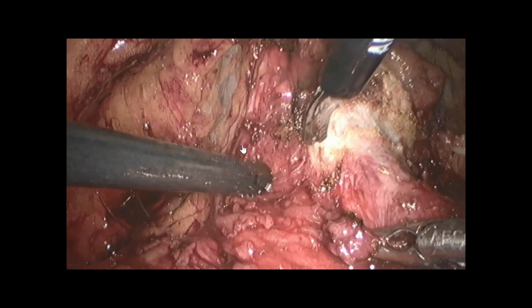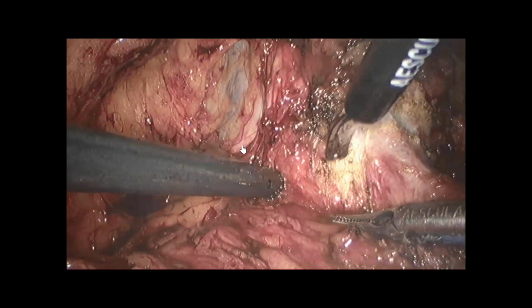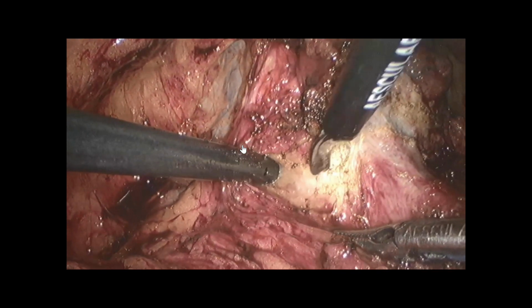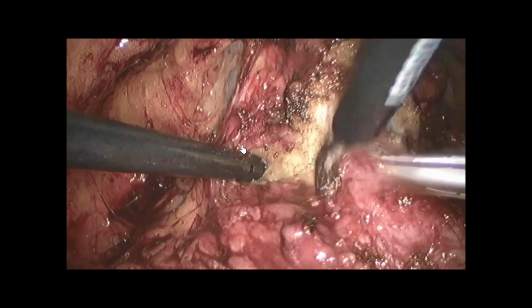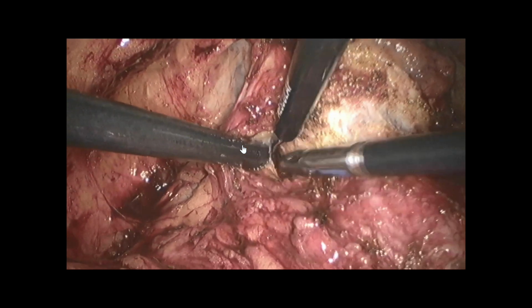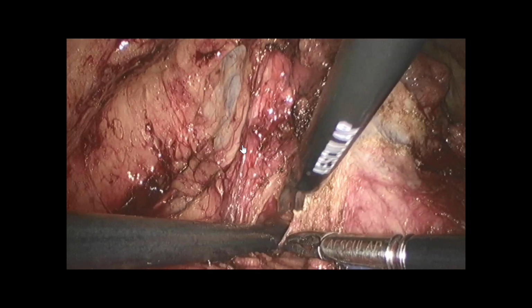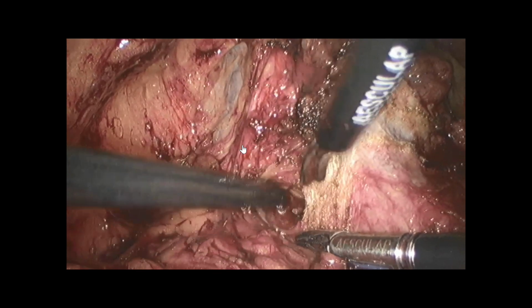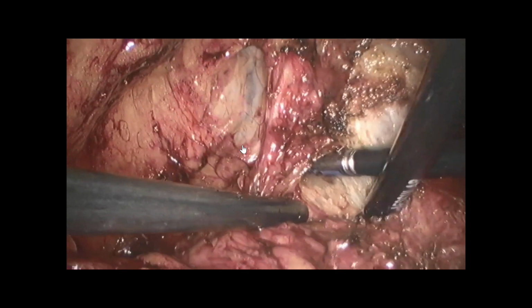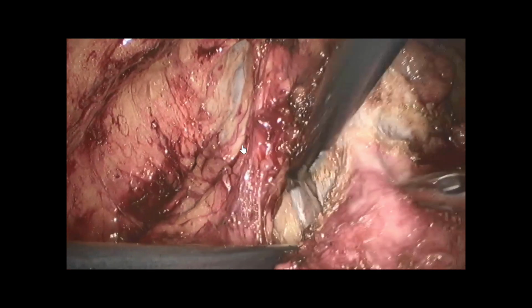So you see the exposition. My assistant is lifting here. The suction device is doing suction but also exposing. And then I'm doing a V incision. I mean that I'm not straight, I'm going posteriorly here to find laterally the seminal vesicle. You see how important it is to expose. This morning I made a hole here because I was not well exposed. It's not a problem, you can repair, but it's better if you can avoid it.